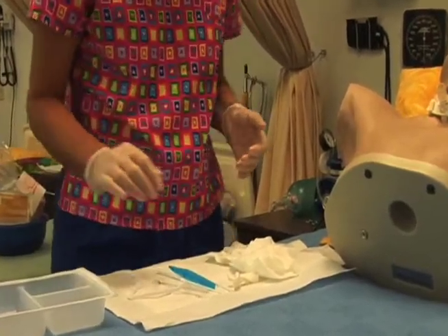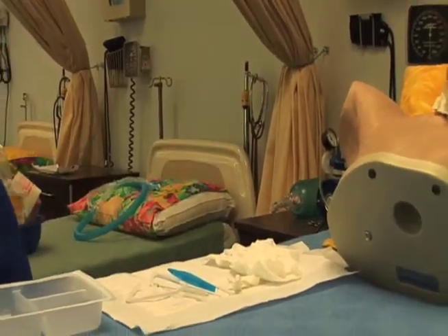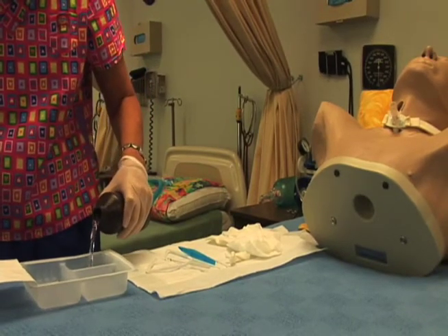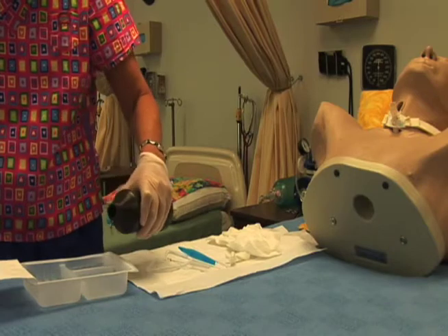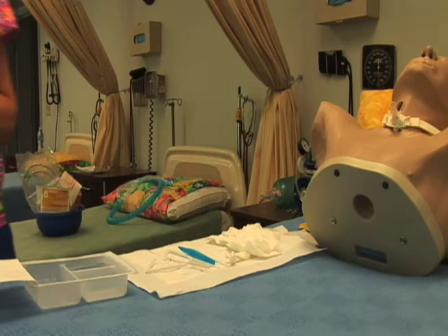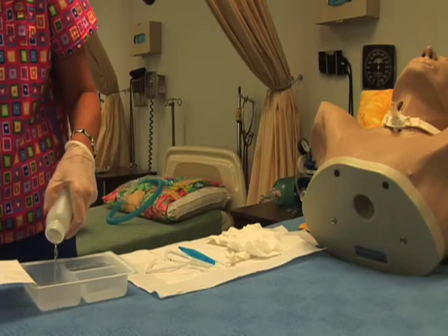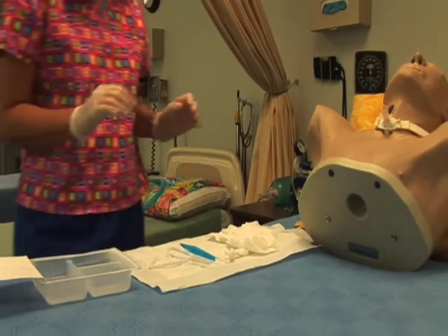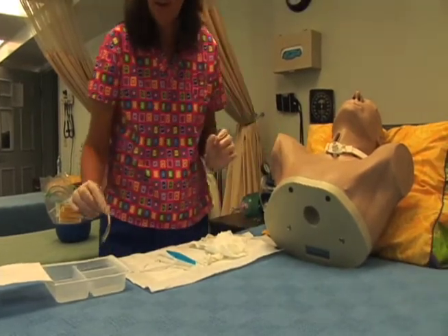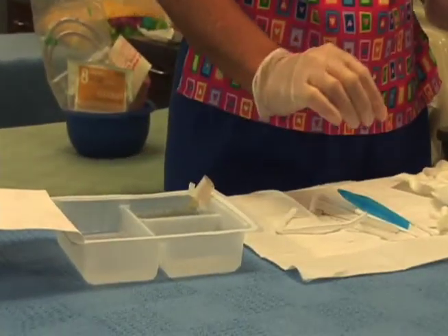At this point I'm going to designate my unsterile hand, take my peroxide bottle, and pour peroxide here, and I'll pour some peroxide here, and I will pour some sterile water. Okay, with my sterile hand, I'm going to take the inner cannula of the trach and drop it in here and just let it sit for a minute while I'm cleaning the outside.